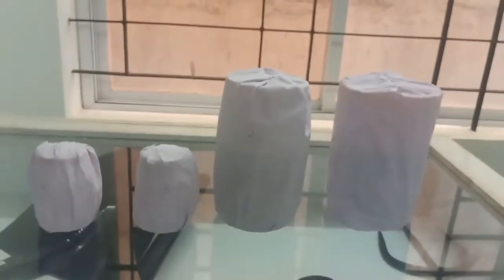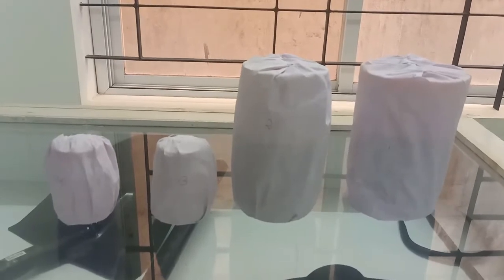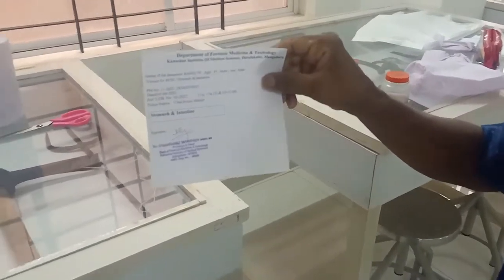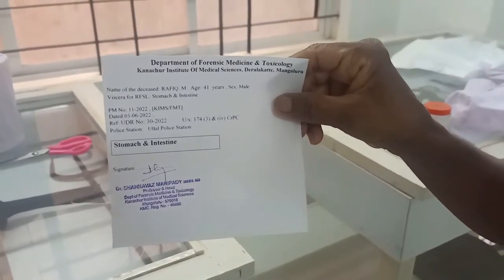Now all four bottles have been packed, and the labeling process will begin. After packing each bottle, that particular bottle is labeled as follows.